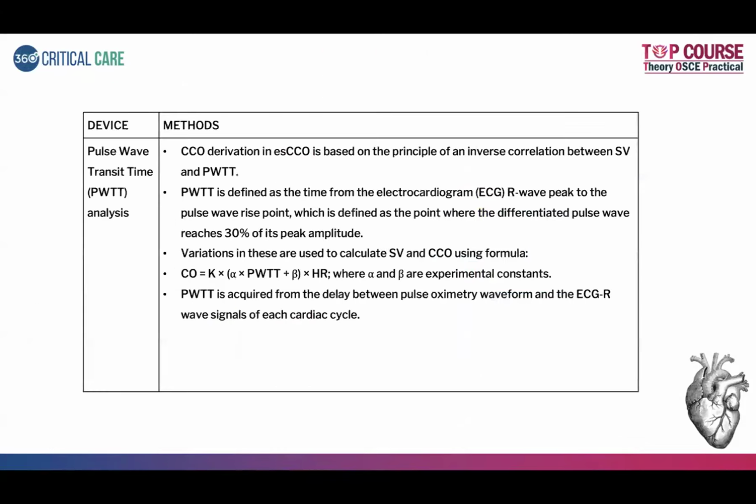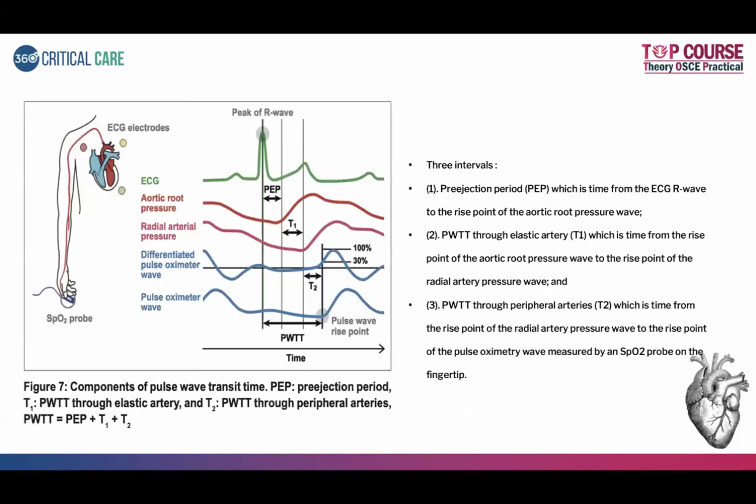The last non-invasive method is called pulse wave transit time analysis, where the cardiac output is derived on the principle of an inverse correlation between stroke volume and the pulse wave transit time. So what is pulse wave transit time? It is the time from the ECG R wave peak to the pulse wave rise point, which is defined as the point where the differentiated pulse wave reaches 30% of its peak amplitude.